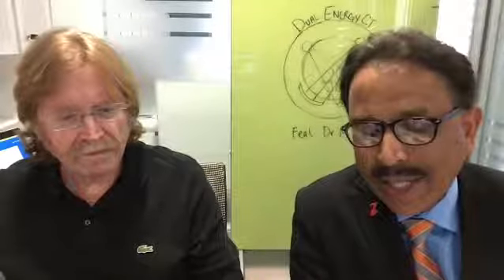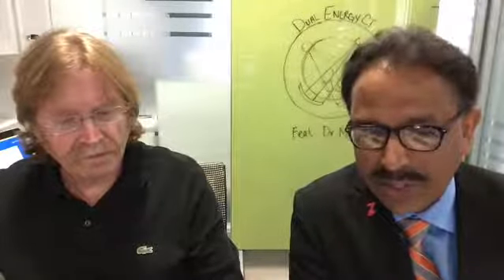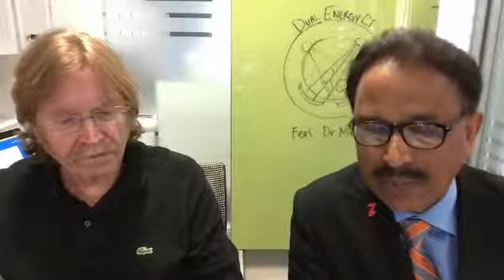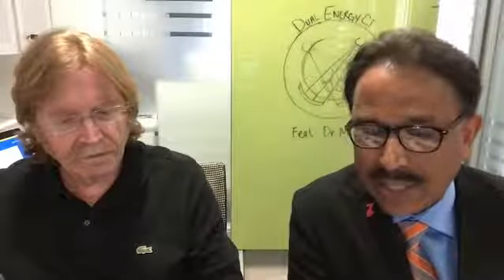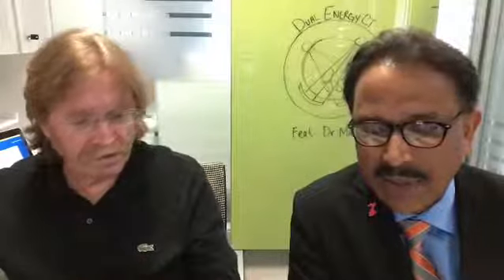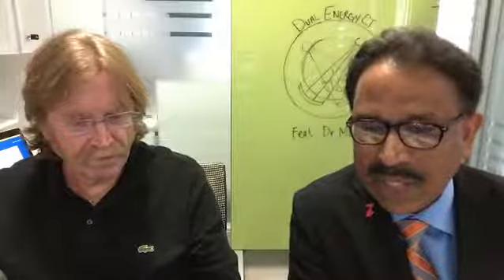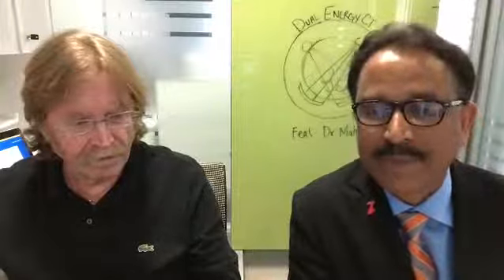So what is dual energy? Basically, dual energy is like scanning a patient at two different energies, getting signals out of the body at two different energies. Therefore, we can decompose the materials into three different things, and we can isolate and visualize the objects much more clearly. So the funny thing is, this has been around for almost 10 years, and the technology is uniquely different from each manufacturer. And that is a uniqueness because not all of them have gone the same way to create dual energy data sets.